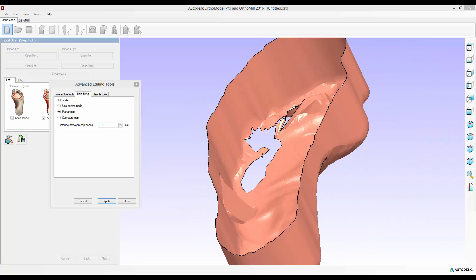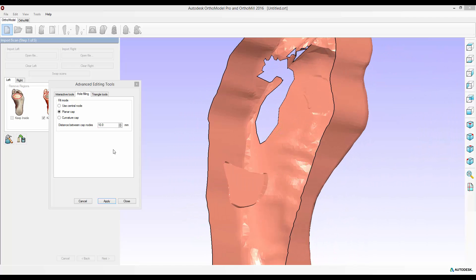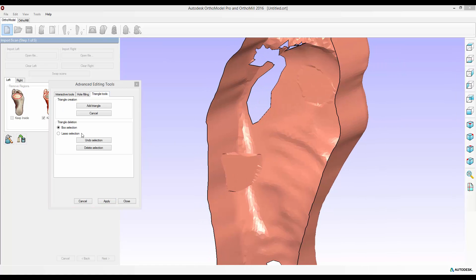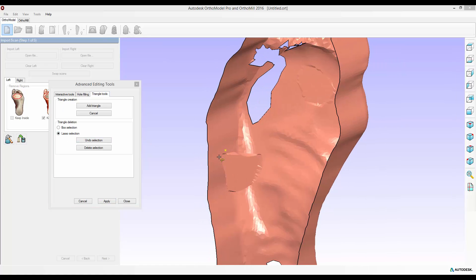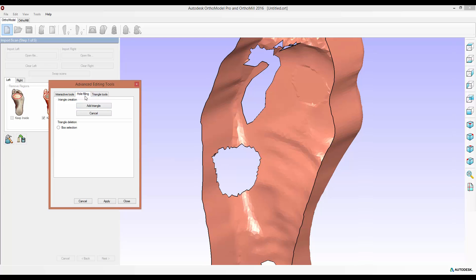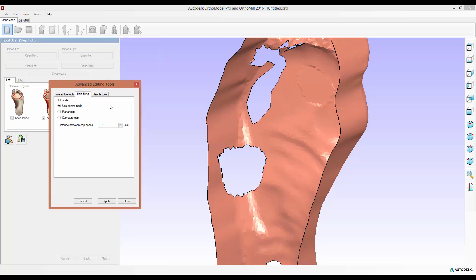I'll go back to the triangle tools and delete this again and show you the last option, curvature cap. Curvature cap, unlike planar cap, follows the contours of the mesh that it's attached to. You can adjust how accurately it does this using this distance between cap node selection. The smaller you have this value the more accurate the hole filling will be, but also the longer it will take to calculate and the more dense your mesh will be for future operations.